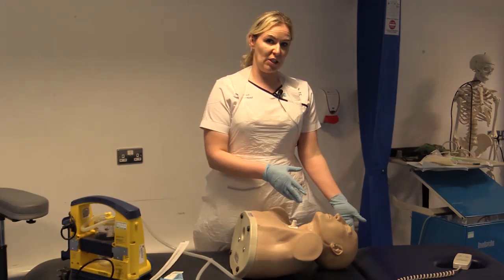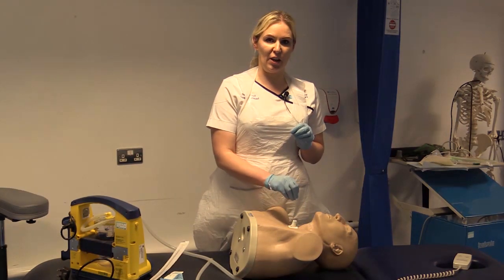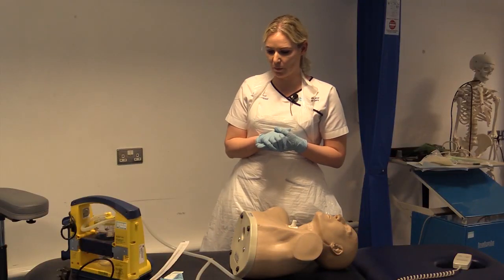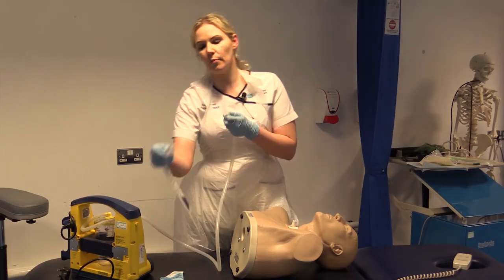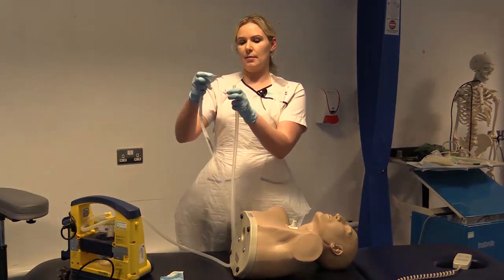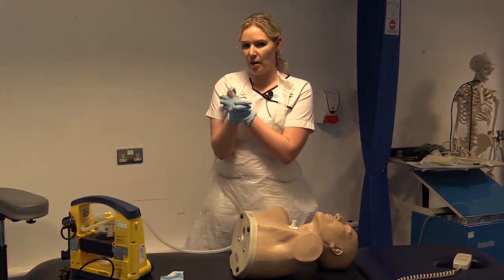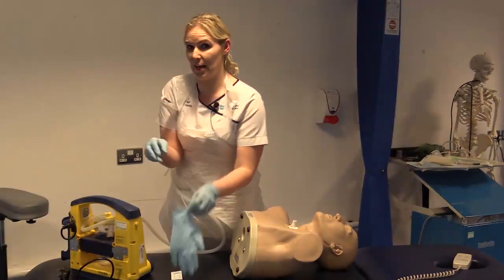Again, you're going to explain to your patient what you intend to do. You're going to pre-oxygenate your patient for 2 to 3 minutes prior to your suction. You're going to check the patient's clinical obs prior to proceeding with your suction just to make sure they're satisfactory. We're going to choose our appropriate size catheter. We're going to insert into our suction tubing just by exposing the upper end and attaching it, keeping the rest of the catheter in the plastic sleeve to keep it as clean as possible. We're going to pop that in underneath our arm. We're going to apply our second glove, and that's going to be our clean hand and the only hand that touches the catheter.